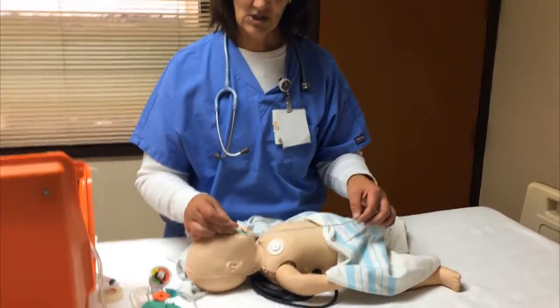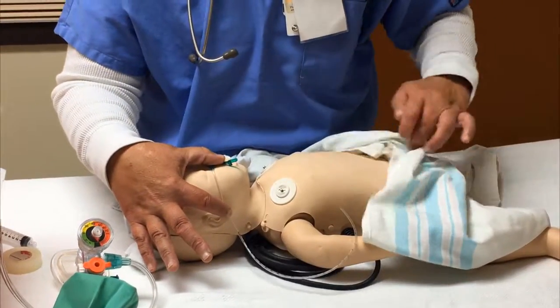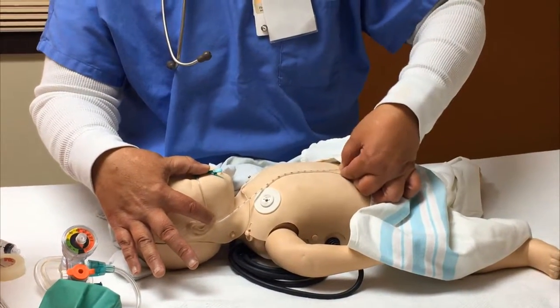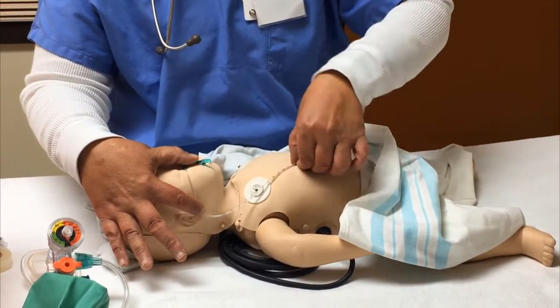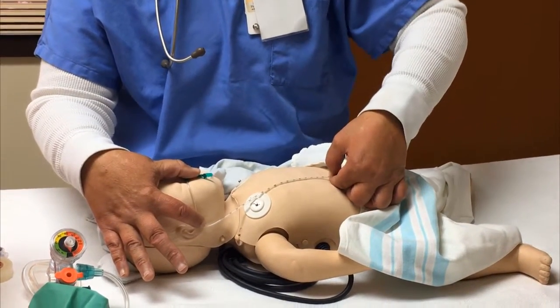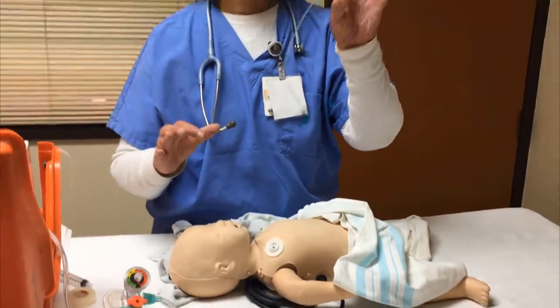So we're going to start at the bridge of the nose. I'm going to go down to the earlobe. And then we're going to bring the orogastric tube to the middle of the abdomen, in between the xiphoid process and the umbilicus. And we're going to mark the distance. Okay? The distance here is 11 centimeters.